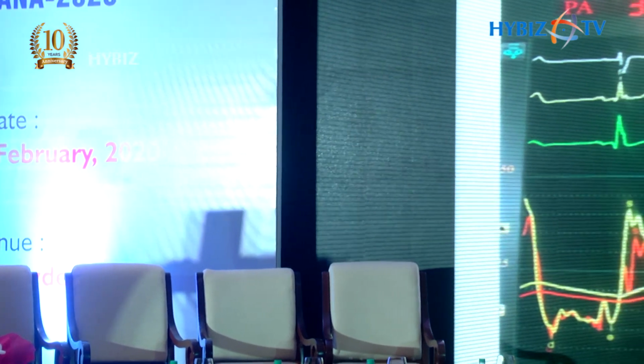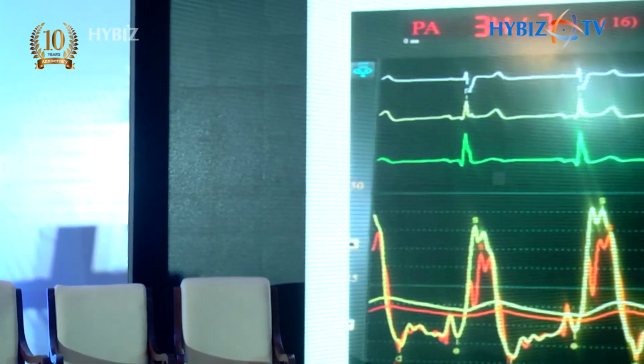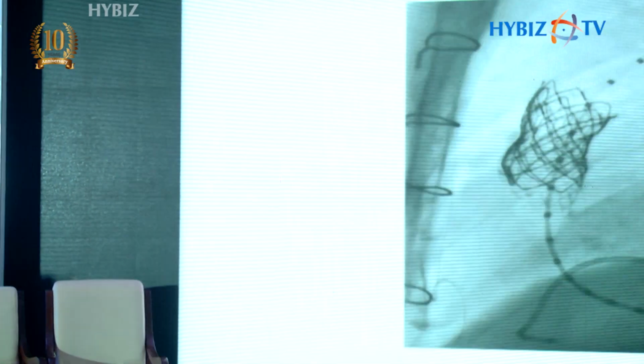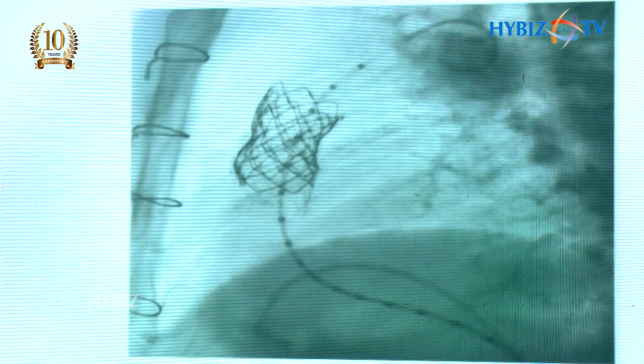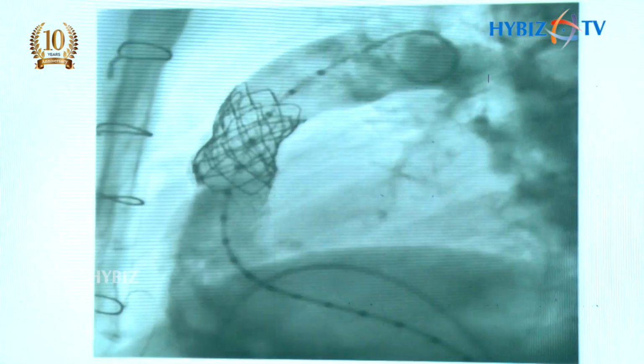Pulmonary valve implantation. A patient who is getting a melody valve implantation, a melody valve is fully inflated. Post procedure, you take the hemodynamics, RV pressure and PA pressures both look similar. That means pulmonary artery is ventricularized. That means pulmonary regurgitation has not been corrected. Look at the angiogram. In spite of the melody valve, there is a severe PR. That means the valve leaflets are not functioning at all. This has been identified prior by our catheter hemodynamics itself.